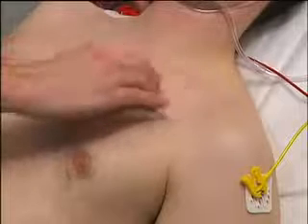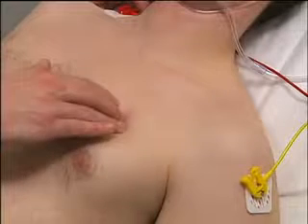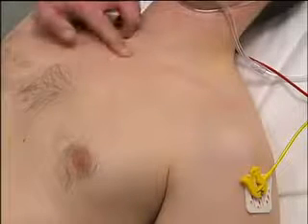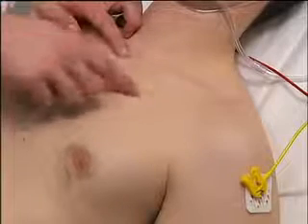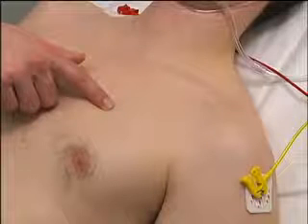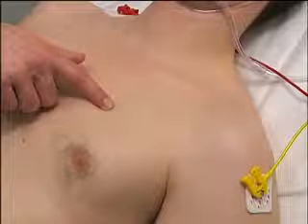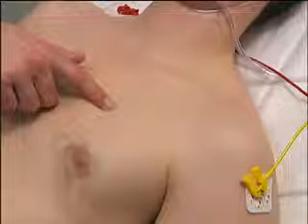The second rib is the first palpable rib that can be felt just below the collarbone. Then locate the third rib. The second intercostal space is the area between the second and third ribs. Next, identify the middle of the clavicle and the mid-clavicular line. The intersection of the mid-clavicular line and the second intercostal space is the correct place to insert the needle for aspiration of pneumothorax. It can be helpful to mark the needle insertion site with a skin marking pen.